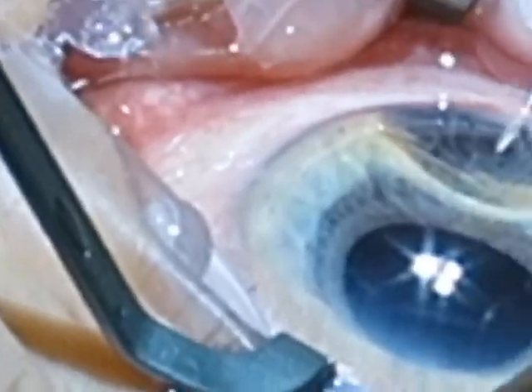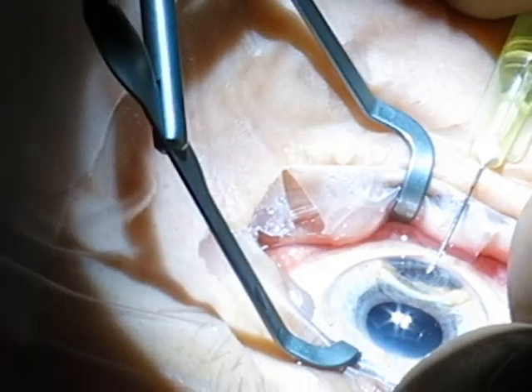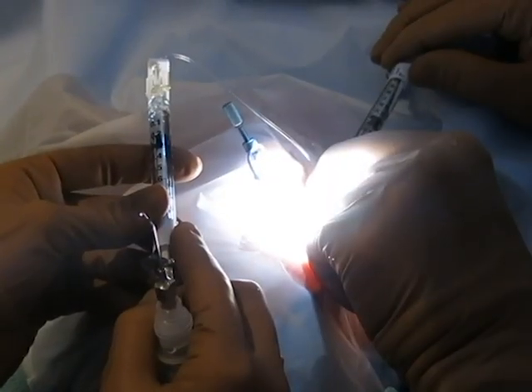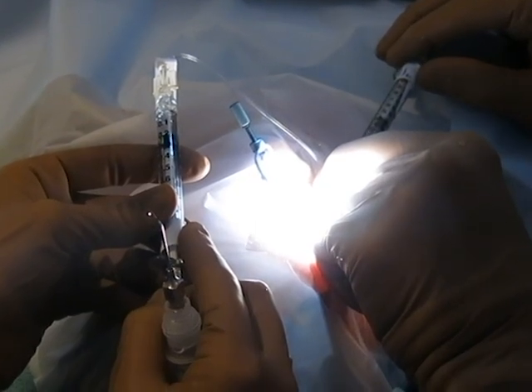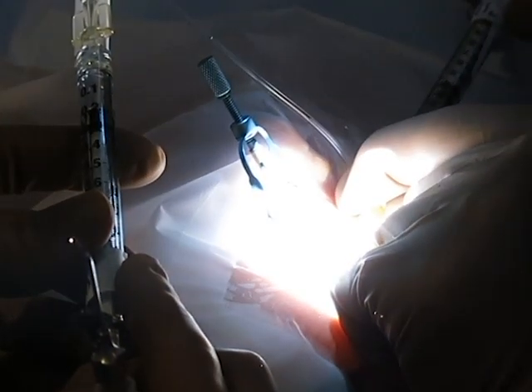Here's another view shot with a cell phone video, and I apologize for the quality, but it shows the setup. The surgeon holds the needle in position, and because of the delicacy of the aspiration and irrigation, I like to use an assistant to control one or the other of the syringes. This allows for a fairly precise control of the volume and reduces the risk of rupturing the cyst.